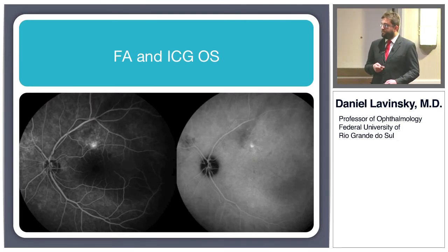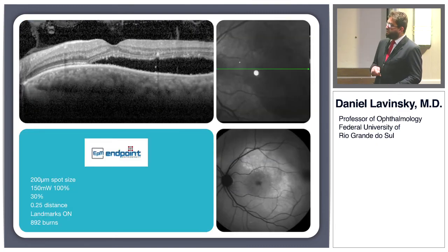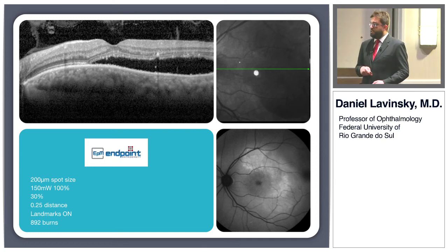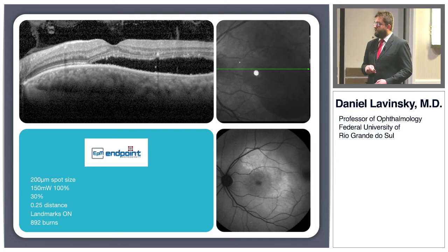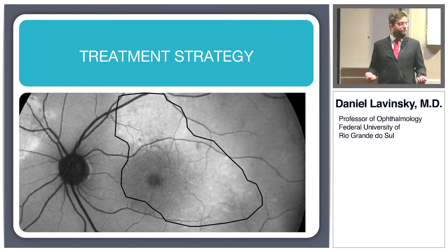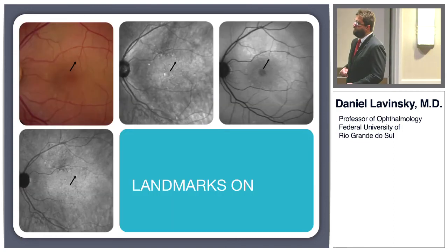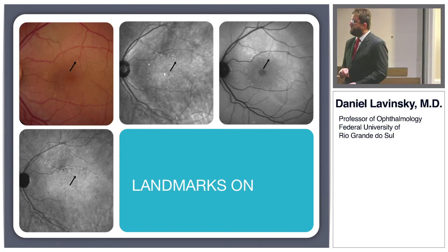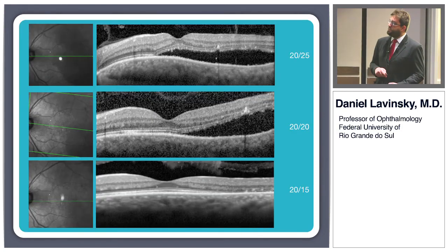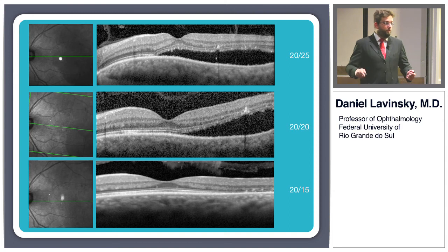It was above the fovea. So this is the point of leakage. And also we have here the area, so it's detaching the fovea. And this is the pattern. So I had to apply more burns to actually cover the whole area of hyperautofluorescence. And also landmarks on, so we can see in the whole multimodal imaging. And this is a slower response, so we attached the whole area in the posterior pole.